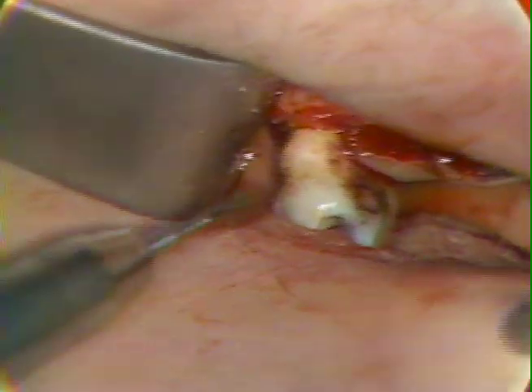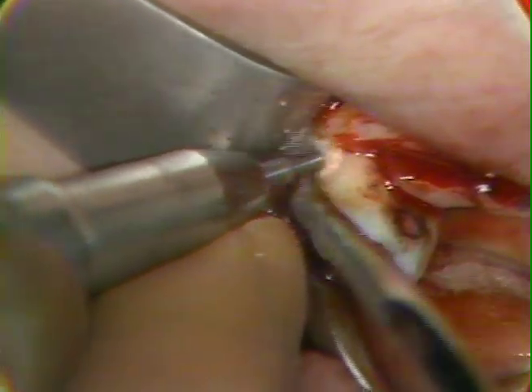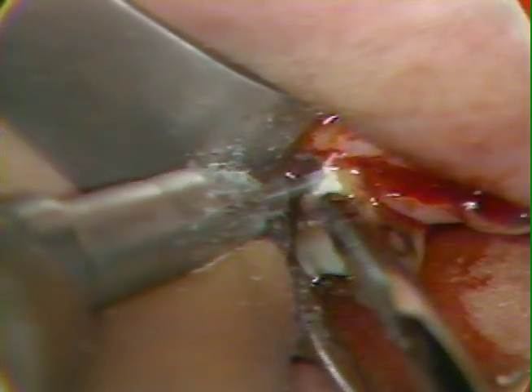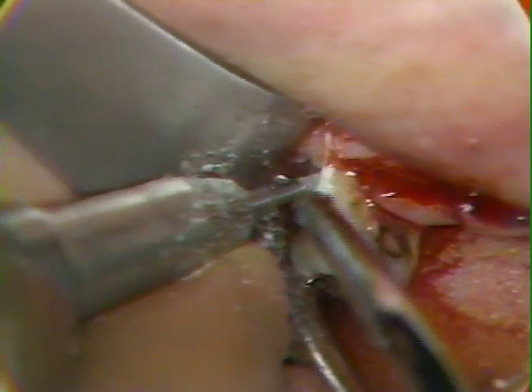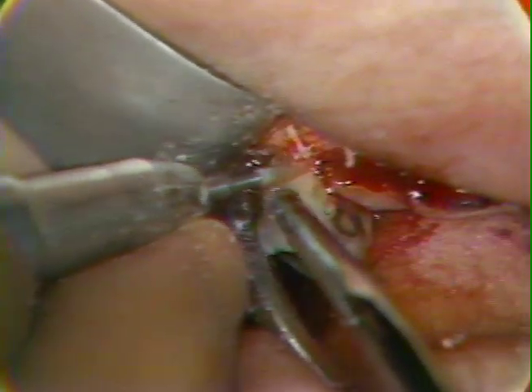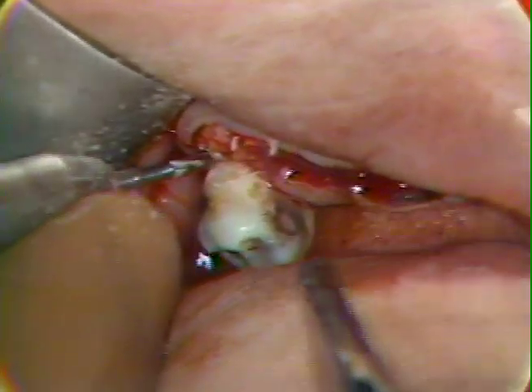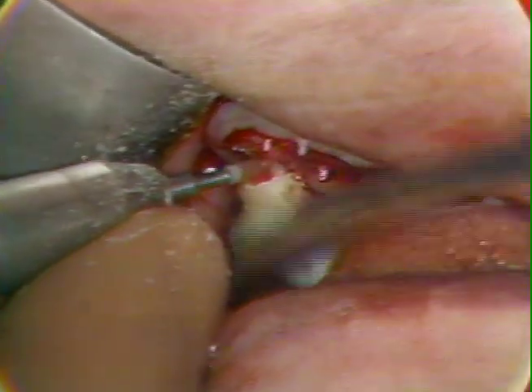And the cross-cut fissure placed here will be used next as we go in to cut off these roots. Let's try to slide under there again. There we can see it, and we'll move in to try to divide these two buccal roots. I'm cutting these roots off at an angle that is inclined toward the occlusal in order to leave us some root to work with.